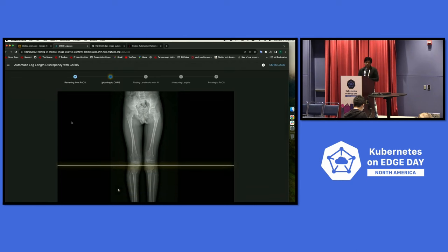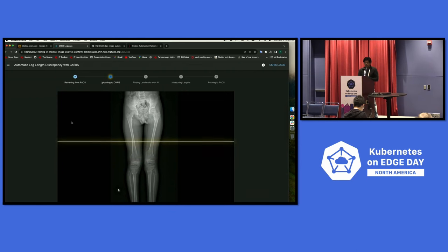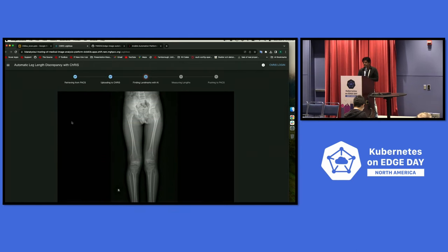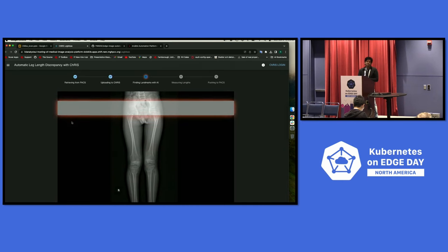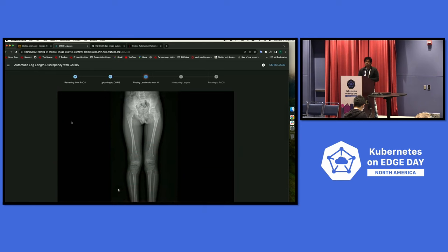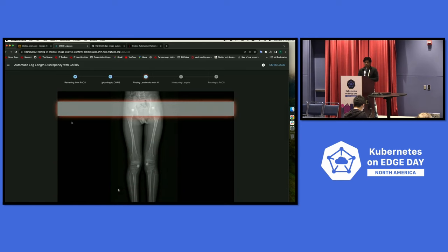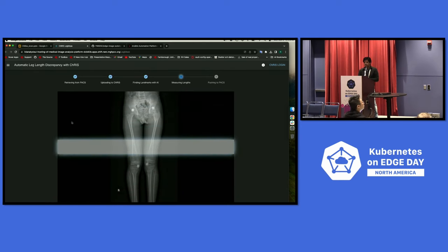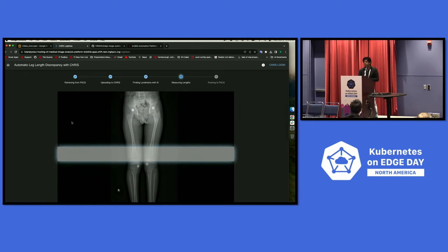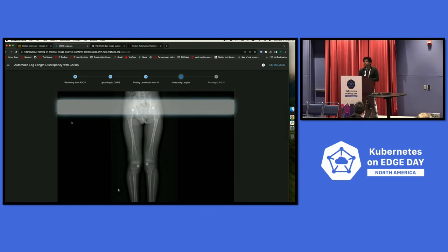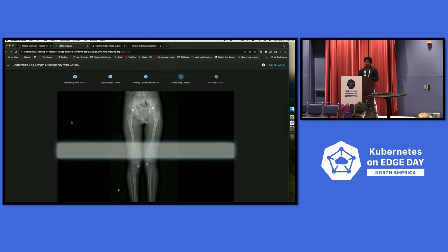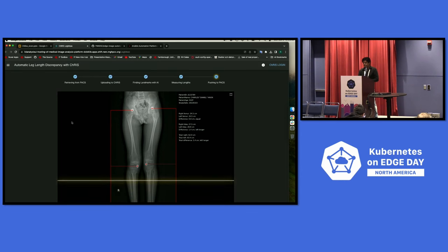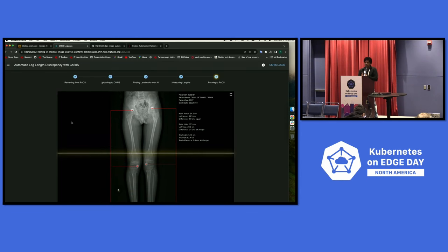If you're in healthcare, I'm sure most of you would know what a PACS is or PACS ORAs. Once the data is received, it's uploading to Chris, and this is where it gets interesting: finding landmarks with AI. It's using a specific Chris plugin that will be using a pre-trained model, and that will be finding some landmarks. Once that's done, it's going to be doing the measurement of lengths based off the x-ray. This is another plugin too, and it also has some data over there once it's done, and then it's pushing it to the PACS.